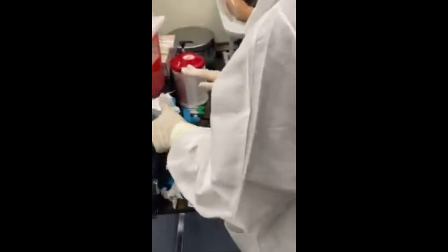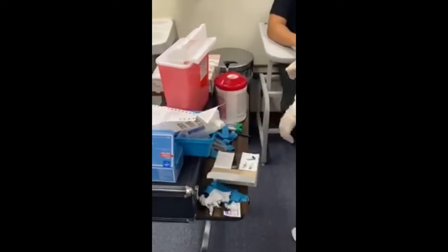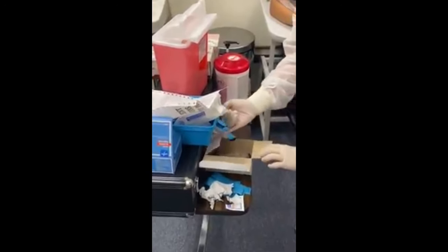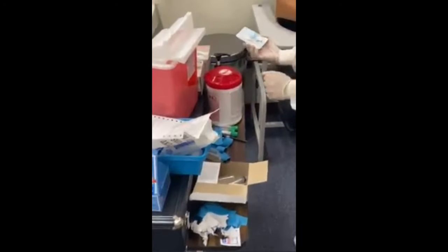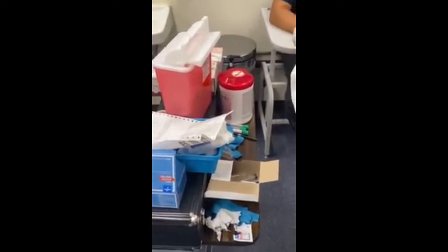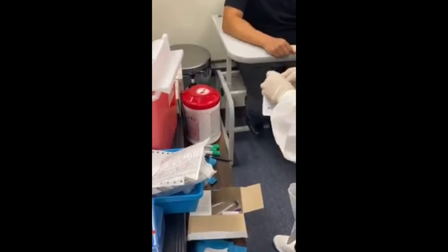I'm going to be touching everything again. And also, sometimes I have to open drawers and touch other stuff. So if you feel like the gloves have been compromised, you can always change out as well. That's an option.